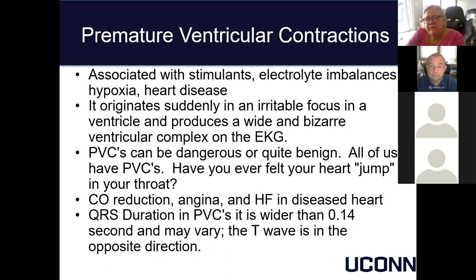Almost everyone feels like they've had one. We talked about PACs feeling like you skipped a beat; PVCs can feel like that also. But one of the hallmarks is the QRS is wider than 0.14.